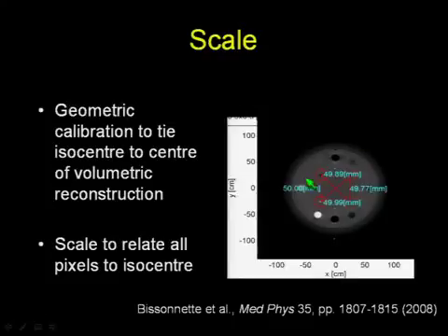So here I'm focusing on rods within the CatPhan phantom that are known to be 5 centimeters apart. And again, we have in-house reconstruction software that will assess that distance using the pixels, and hopefully these should be in agreement.